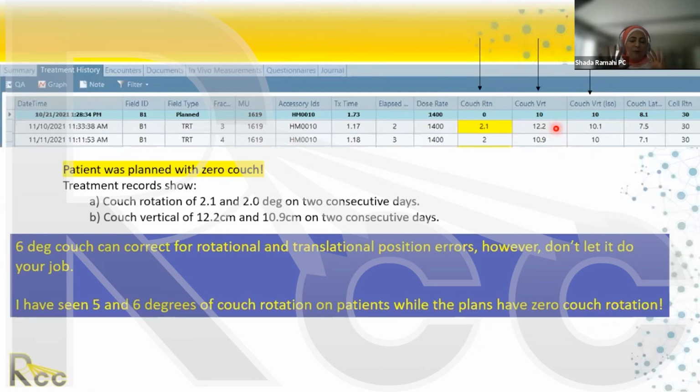You have to look at the patient not just as a number. Remember, we mentioned this yesterday with 4D CT. The computer will give you numbers, but you need to know what's going on inside the patient. But we did put a cutoff at 2 degrees. And after 2 degrees, we have to reposition the patient.